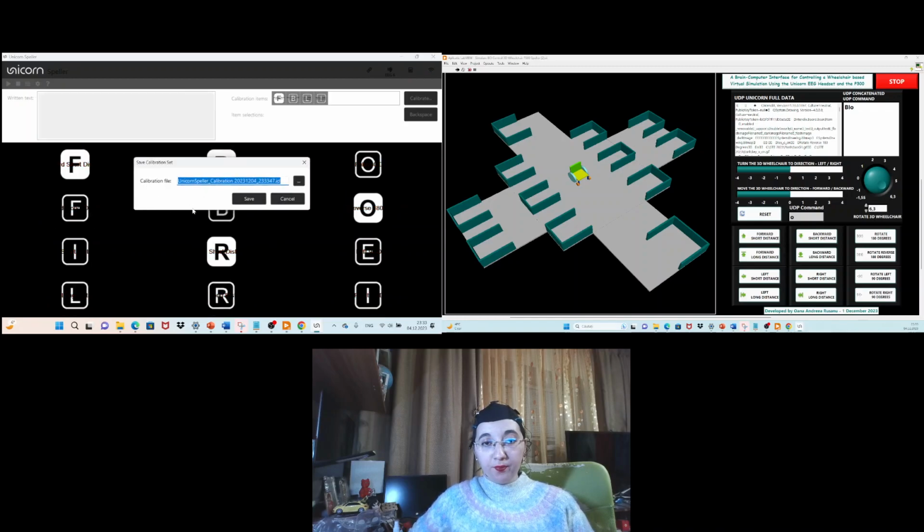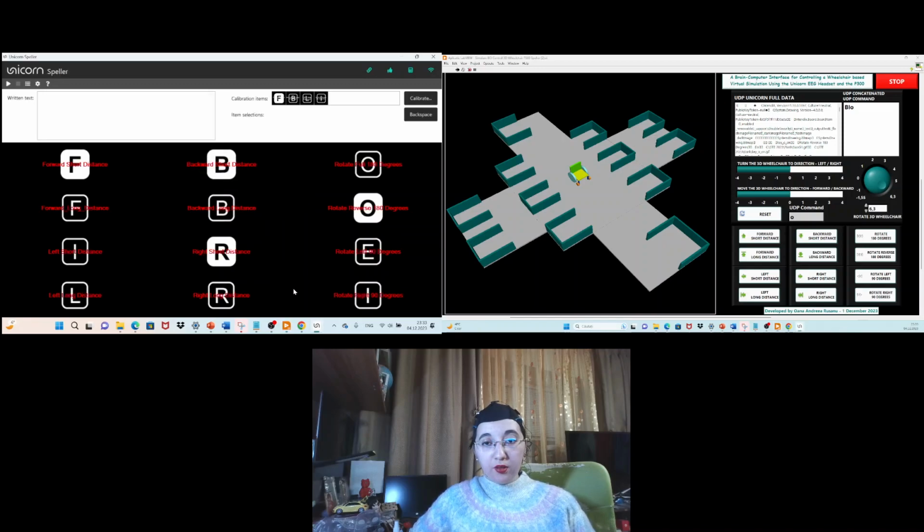Okay, everything perfect. So here is the generated calibration file. As you could see, the dark items or the non-flashing items are based on the letters, and the flashing items are based on human faces. All symbols are the official items provided by the g.tec Unicorn. I chose this option because of the reduced dimension of the UDP data packet that is transferred from the Unicorn interface to LabVIEW.